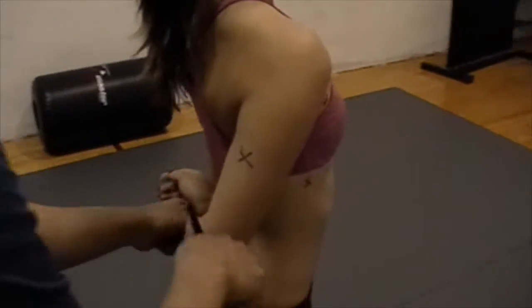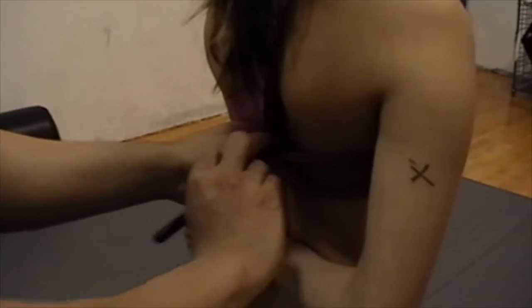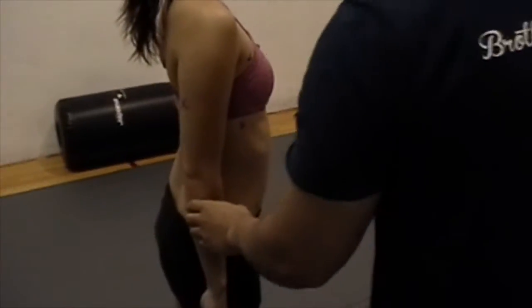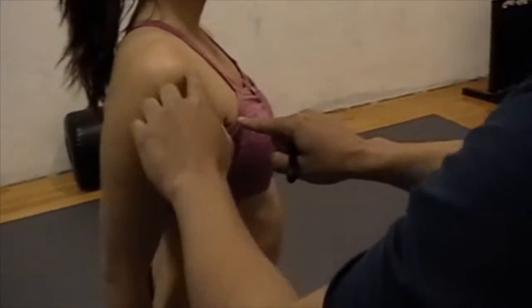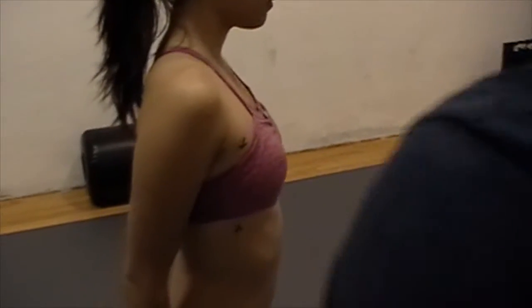Next is the subscapular, which is a diagonal fold with the arm at a 45 degree angle. It is 1 to 2 centimeters below the inferior angle of the scapula. Next is the chest or pectoral. It is a diagonal fold with 1/2 distance between the anterior axillary line and the nipple for men, or 1/3 of the distance for women.